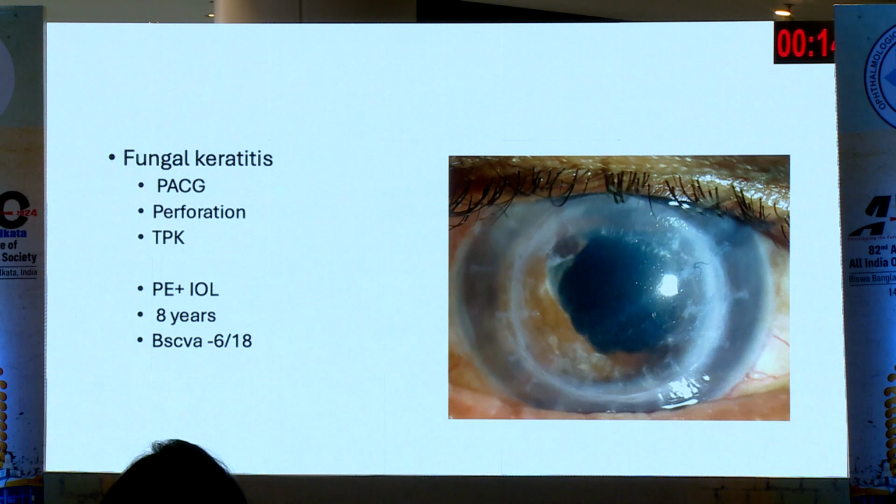So this was a patient who had a fungal keratitis, a patient with PACG who presented with perforation. We did a therapeutic graft.